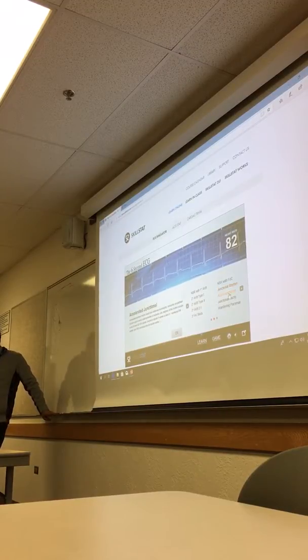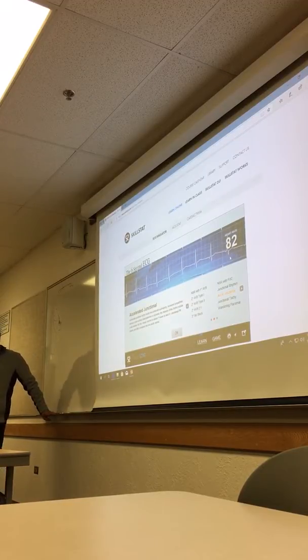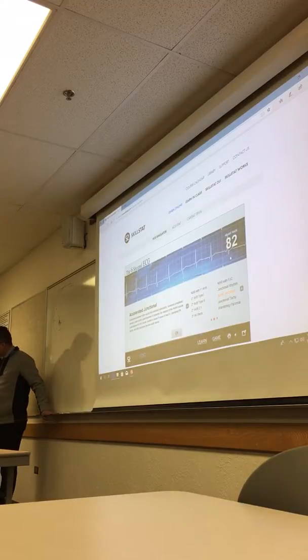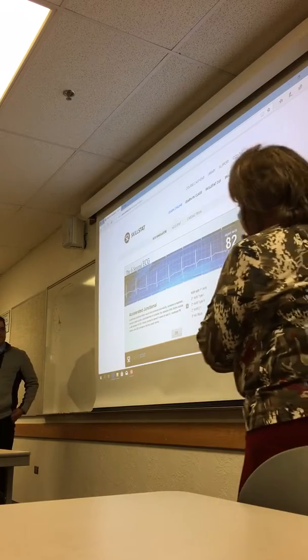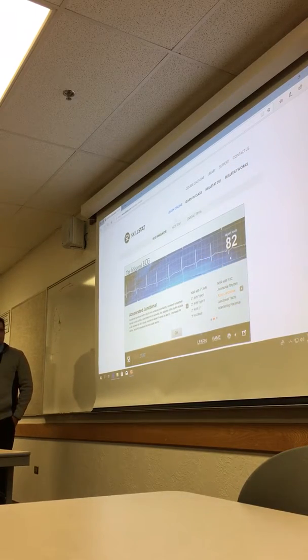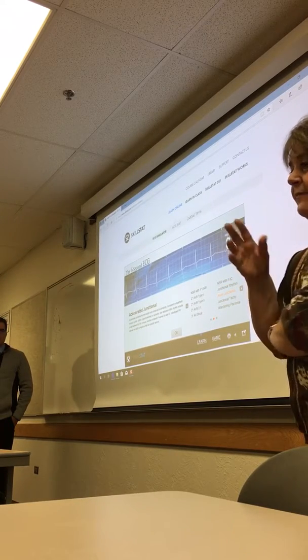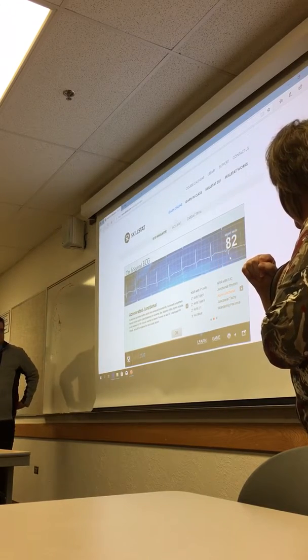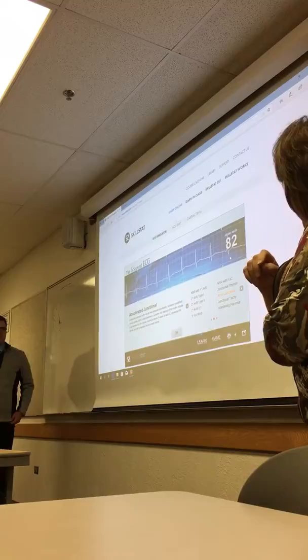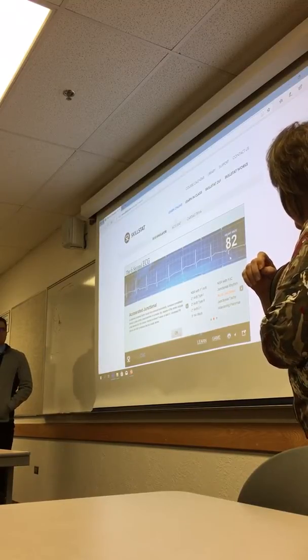Okay, accelerated junctional. This is a junctional rhythm, but it gets a little confusing because we're not in that 40 to 60 rate. This is usually the autonomic nervous system, fight or flight, caffeine, they saw a bear, they're excited, whatever. And so their rate is increased. P waves may be absent, but you can also have inverted P waves. These are inverted P waves.